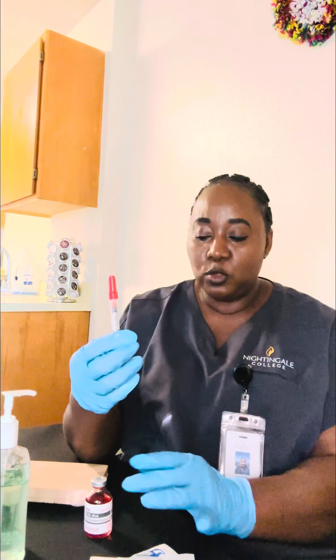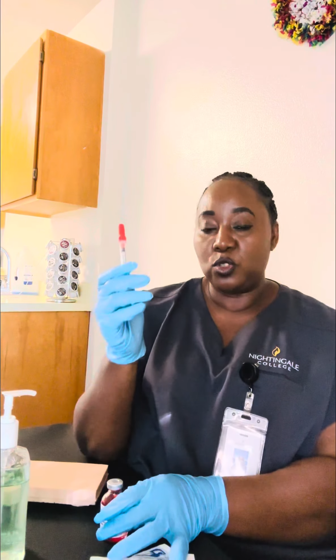Since this is done, I'm also going to check to verify that this is in line with what is in the EHR. So the order is to have tuberculin skin test and administer 5 TU over 0.1 ml. I have the tuberculin here, 0.1 ml. It's supposed to be administered intradermally and is 1 dose, which I'm going to do.